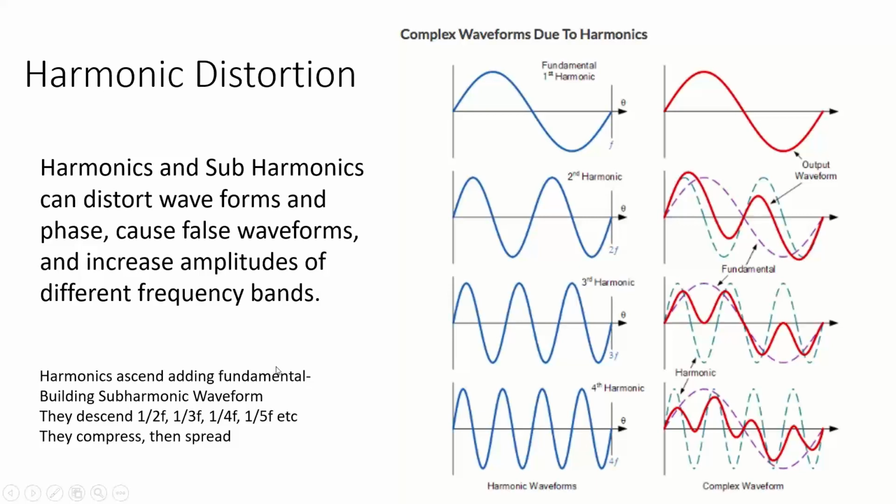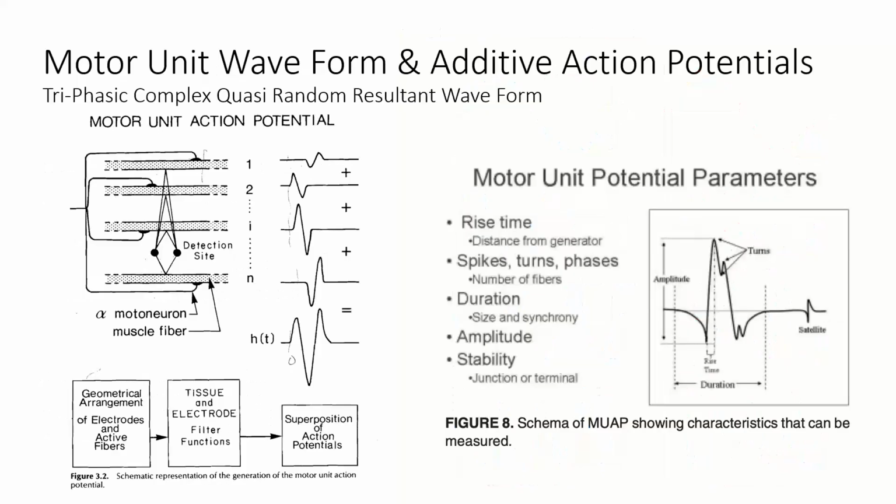And every wave in itself can generate subharmonics. How we define a subharmonic is different than a harmonic. With a subharmonic, you divide the frequency of the wave, let's say it's 20 hertz, by 1/2, that would be 10. And then 20 hertz by 1/3, and then 20 hertz by 1/4, and 1/5. But we don't go down that far, right? The more you divide those subharmonics, the more the energy dissipates, and then it ceases to have meaning.